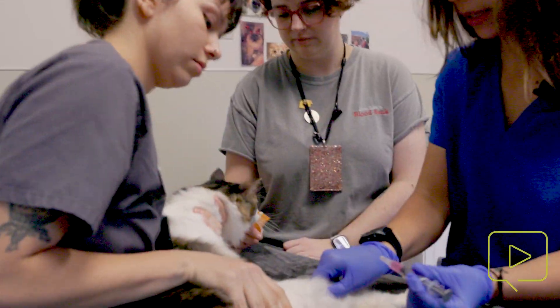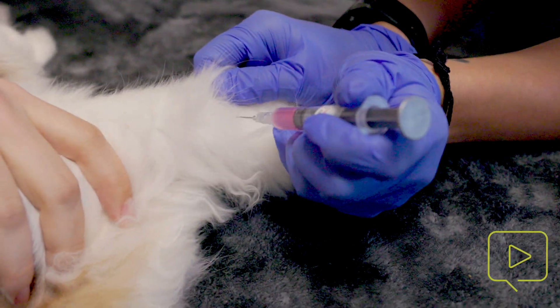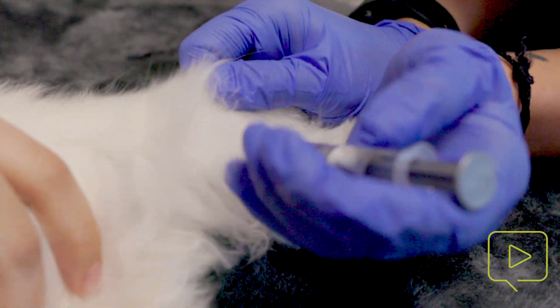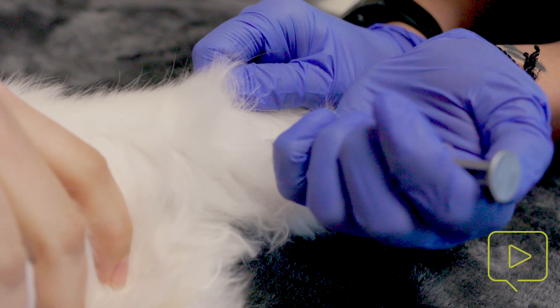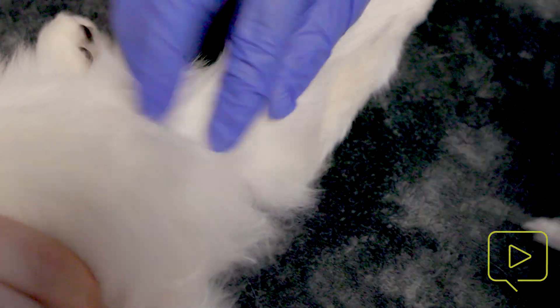We're going to go as low as we can on the right rear leg. We're going to go subcutaneous. I like to tent the skin, going at a 45-degree angle, popping in, and pull back to make sure we have negative pressure confirming we're subcutaneous, and now we're giving.